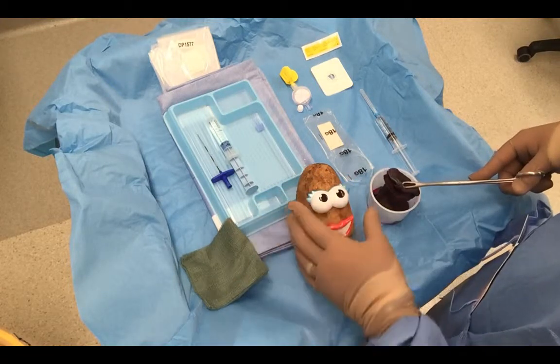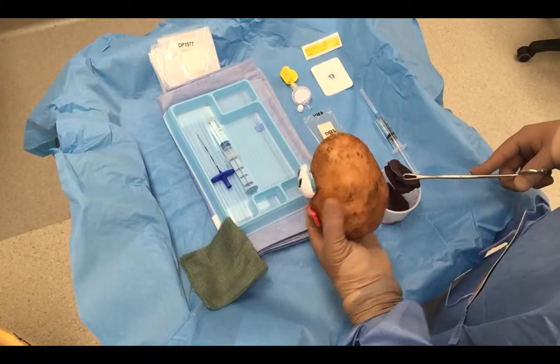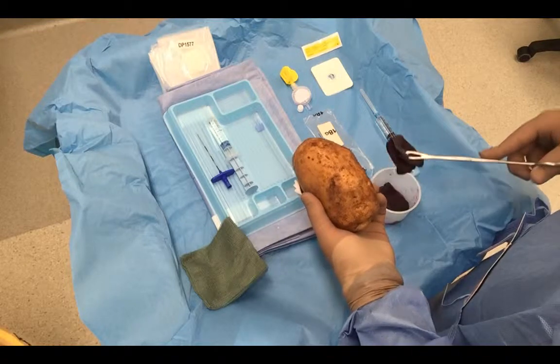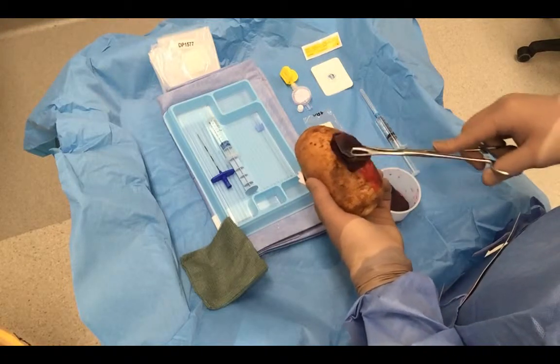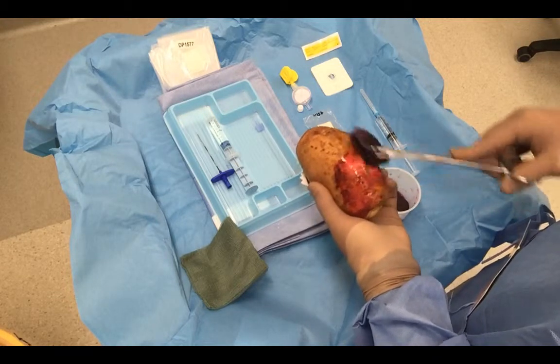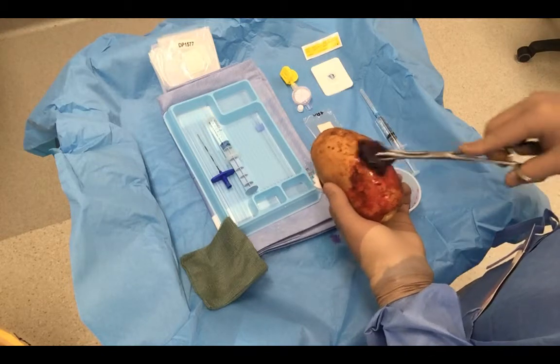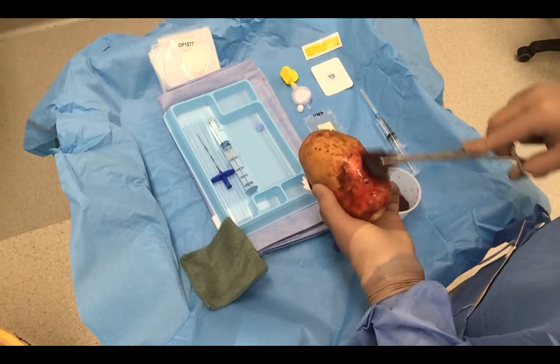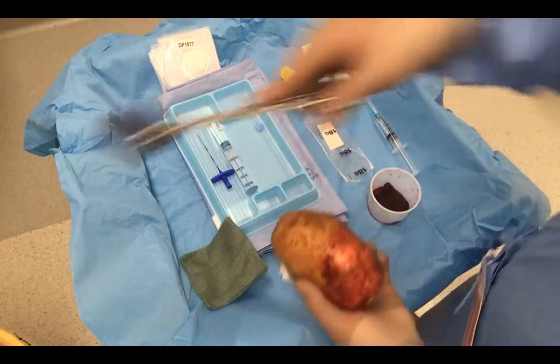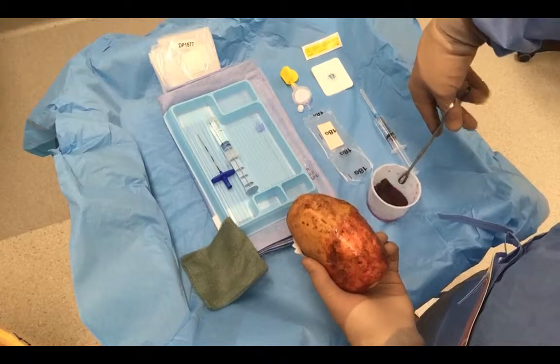You may find that your site on your patient needs, some patients need more cleaning than others. This particular patient is quite filthy, I must say, but this unfortunately is not that uncommon anywhere in the world, and it seems particularly here in North Queensland. Still, we're going to sterilise our field thoroughly, and we're going to remove our prep from the field.